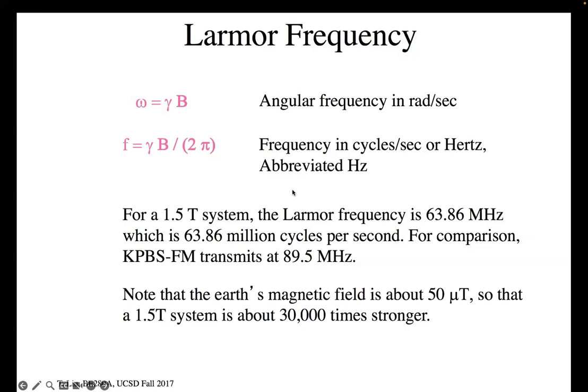Okay, so we left off on Monday with the introduction to MRI. The signal from which we're going to make these pictures is a radio frequency signal that's emitted by the patient. After we stimulate the patient with radio frequency energy, we get RF back. And there is a linear relationship between the frequency of that radio frequency energy, omega, and the magnetic field.